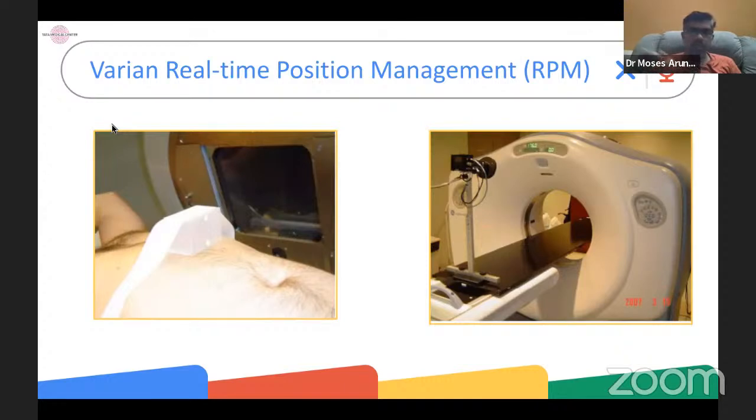In someone who has a scaphoid abdomen, we may have to push the reflector box a little bit higher so that it is as horizontal as possible. Then you have the IR camera at either the foot end of the couch or on the wall at the foot end, which emits the infrared rays and also detects the reflection from the reflector box.